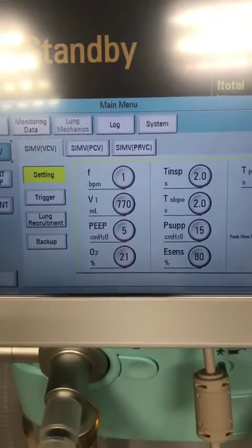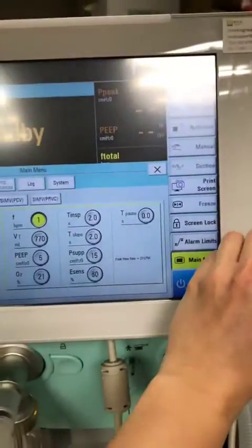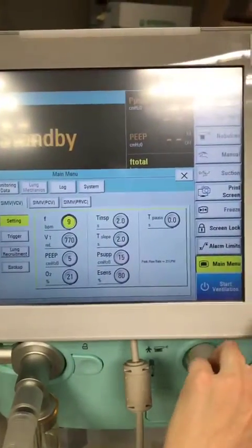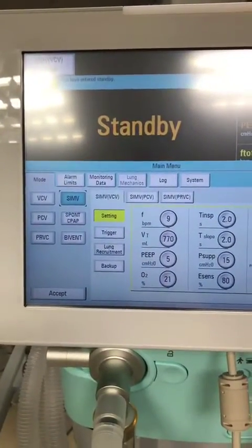You can then set your parameters by clicking the screen and dialing the knob. Just like a Draeger, you have to confirm by pressing it, and then it will go from yellow back to grey again.